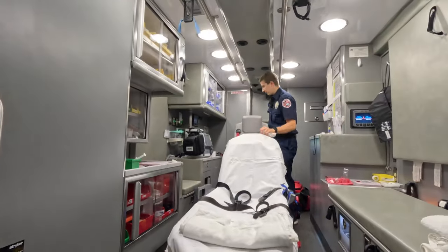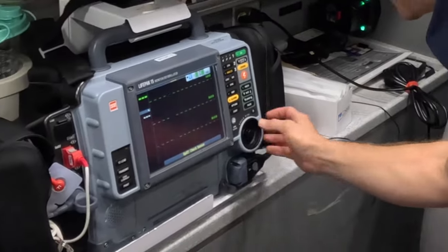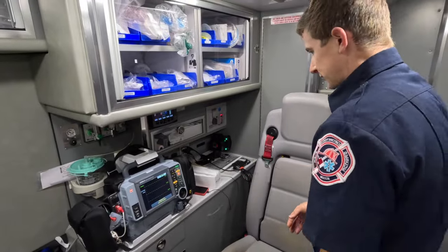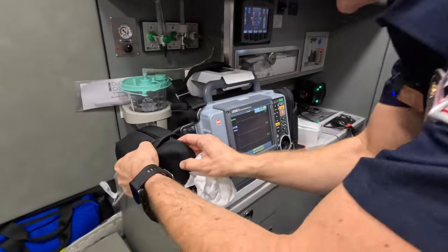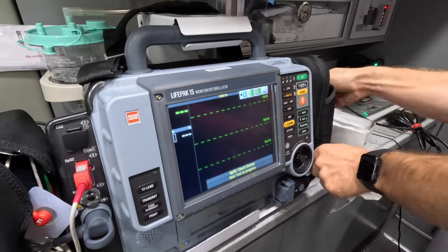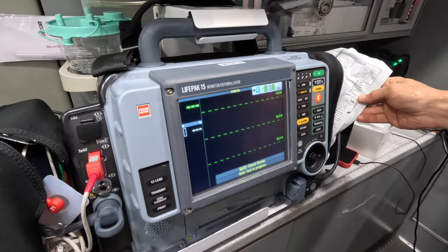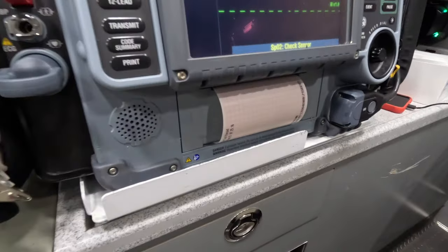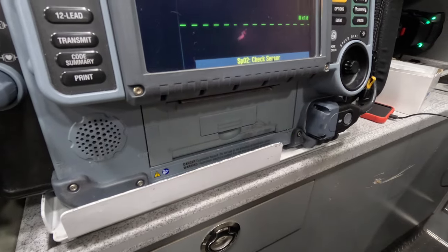Go ahead and power up all our stuff. We're testing our EKG as well — it's doing a self-test just to make sure it can do everything it needs to do. Make sure we have all our cables, pulse ox leads, extra 12-lead on this side, and we need our pads in case we need to defibrillate somebody. The self-test passed, so that's all good to go.